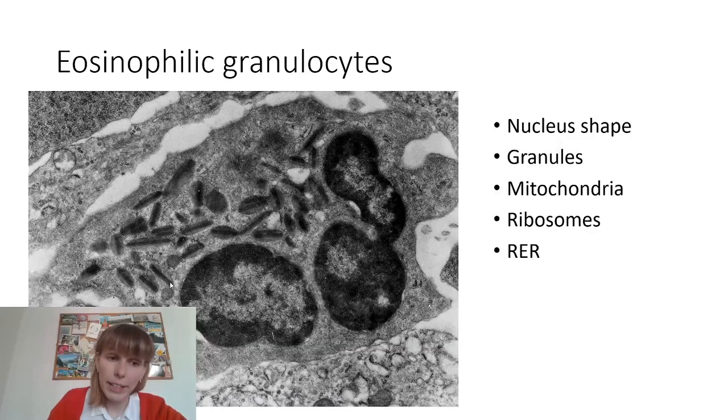They will contain several different compounds that will be helping to kill the parasite, and also to signal other parts of the immune system that something is happening. You see a nucleus here, so both of these three parts are the nucleus, and you see that it's segmented.